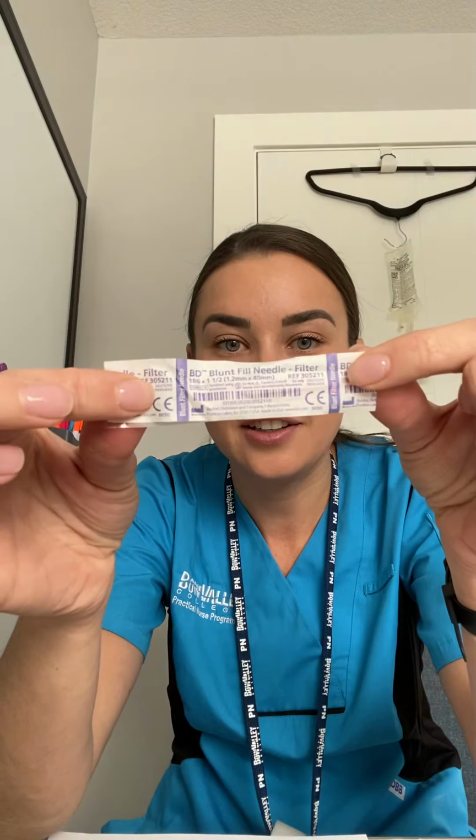So we have the doctor's orders and the MAR here. I guess I could go over my supplies too while we're here. So we have the 0.9% sodium chloride, which we've done the checks on. We have, the lid doesn't really stay on here, but we have dexamethasone, our medication. We have a hand sanitizer, which I've used, alcohol swabs, which we'll need to take in with us as well. A sharps container here, medication label here, second line label here. We also have, for assessment purposes, a blunt fill needle, dry and intact, not expired.